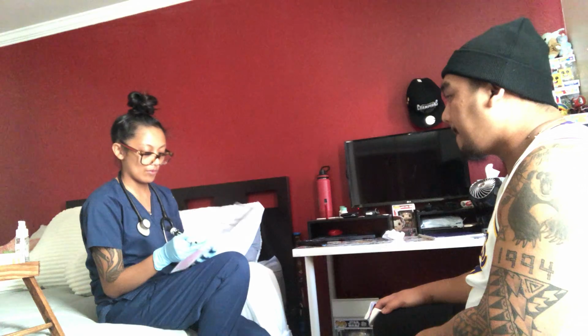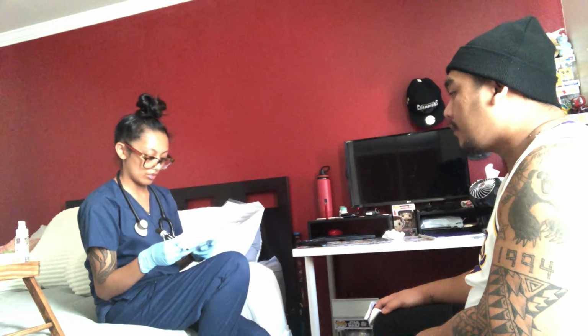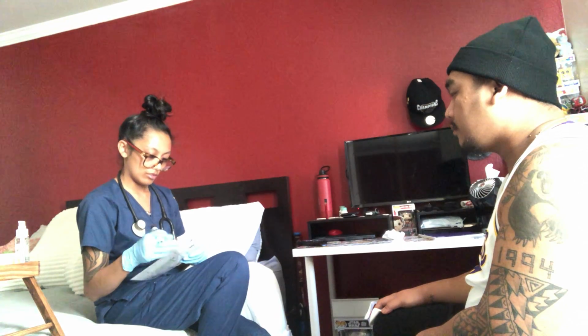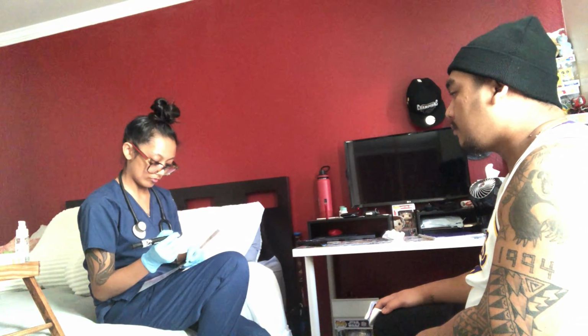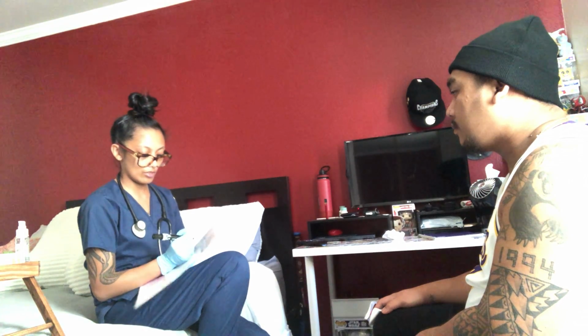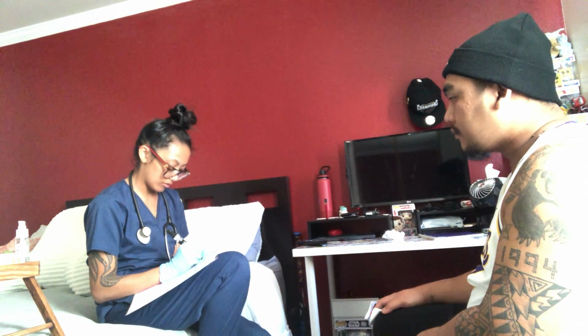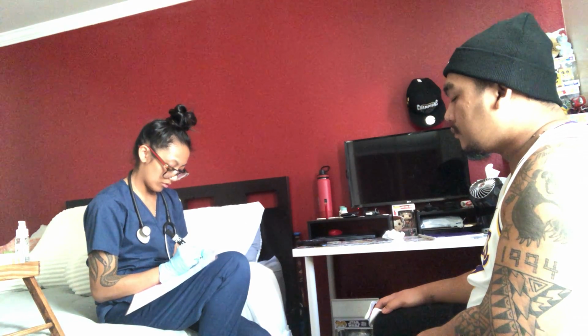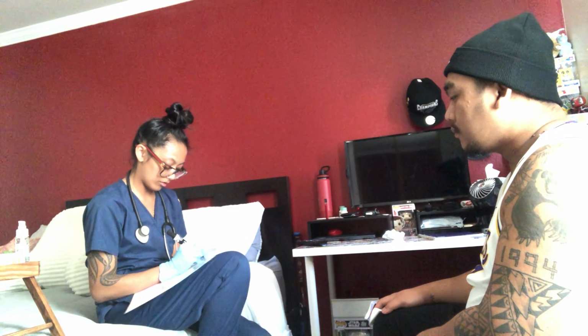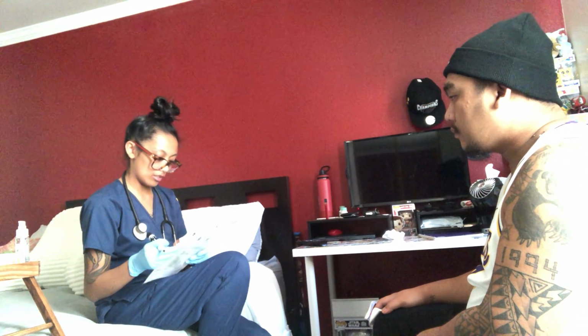Are you having any trouble breathing at the moment? Yes. Yes? Okay. Then may I have you produce a cough for me, please? Okay, just try it. Unproductive. Okay, and now I'm going to listen to your lungs real quick.